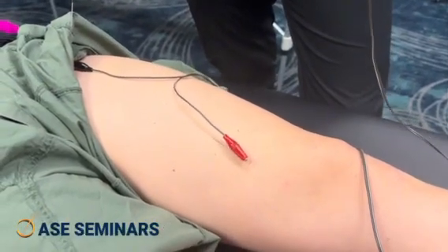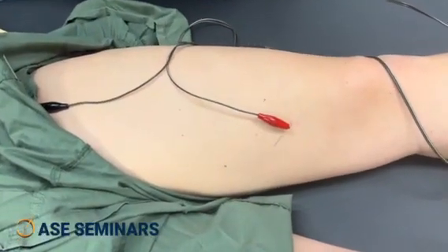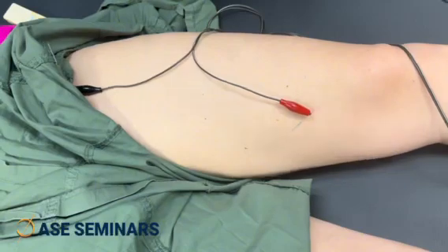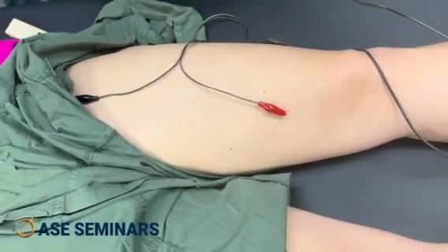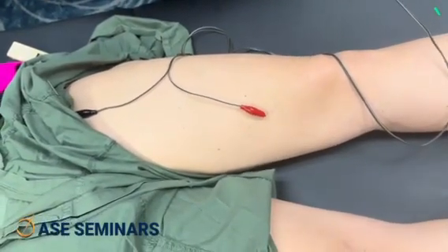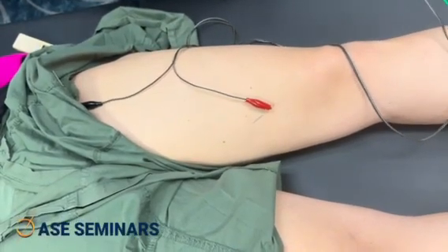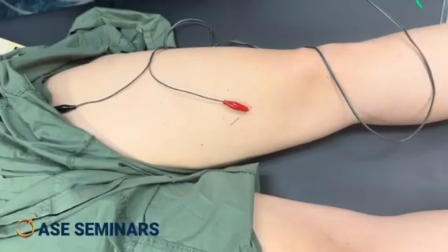I don't want it to be painful — it's not, right? I'm going to increase the frequency because the goal is different now. It's not neuromodulation for pain; I want to get muscle stimulation. I'm going to get close to 10 hertz.